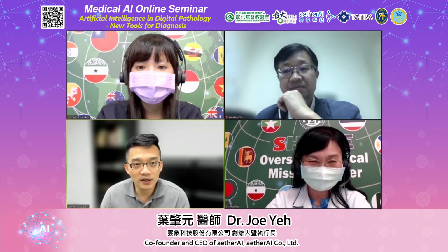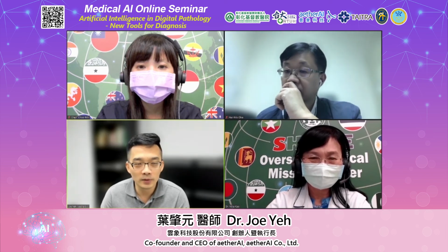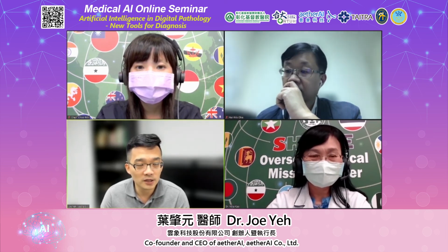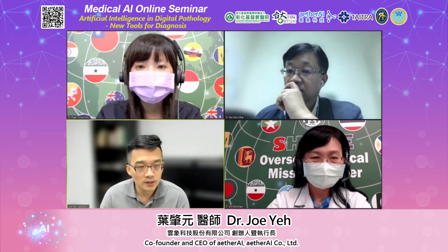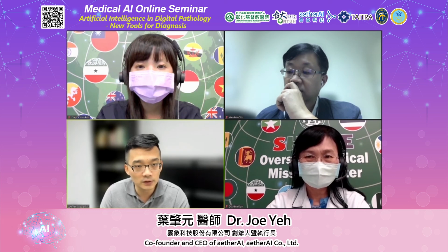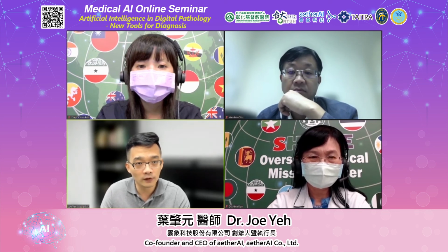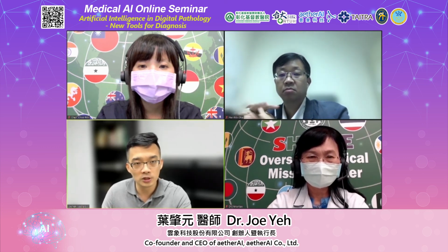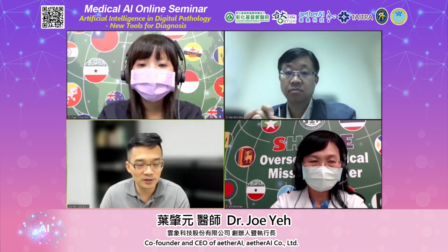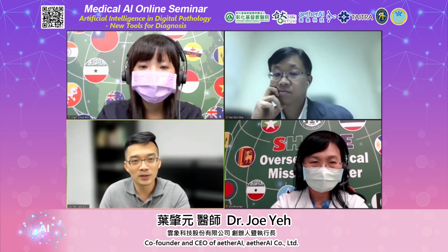On the contrary, I think radiology and pathology will be very interesting disciplines to be practicing in, because in the past, pathologists had no help. They could only rely on their naked eyes to perform quantification, but now they have powerful tools. Let me give you an example. Right now we're using AI to perform nuclear morphometry, so we can actually derive quantitative results for lymphoma cell morphology. In the past, they had to use very vague terms, for example, monomorphic lymphoma versus pleomorphic lymphoma, but now they can actually give you a number for how irregular the nuclear shapes are, and use that to make more precise predictions of the prognosis. So I think radiology and pathology will be more interesting because these powerful tools can help doctors to perform diagnosis at a much higher level than before.